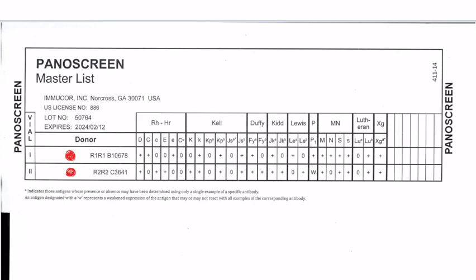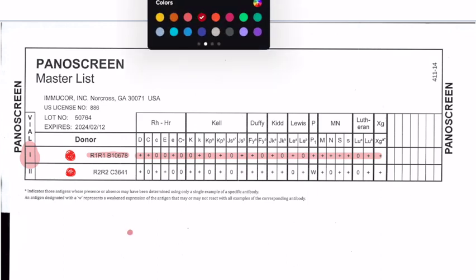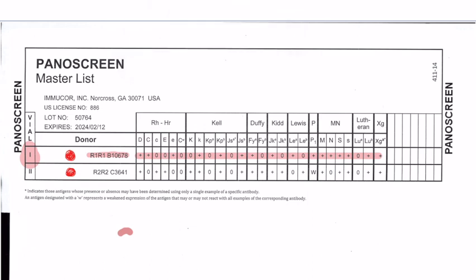So if we look at this, we're going to see that screening cell 1 right here. That's a little big. I want to make that a little smaller here. Okay, so number 1 here. This is the map of antigens that are on the outside of this red blood cell. So if we look at screening cell 1, I'm clicking on the wrong buttons here, I apologize. Here's screening cell 1, we'll just put a 1 inside there, okay? What's on the outside of it?